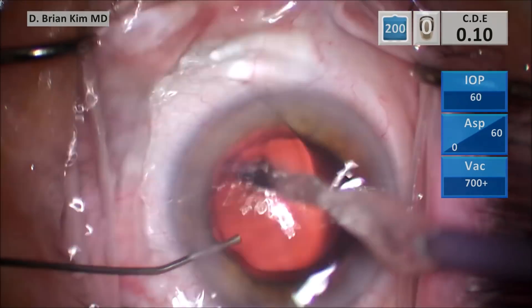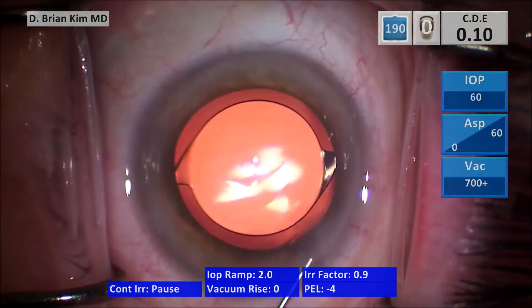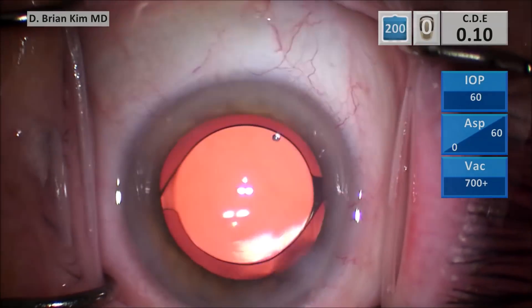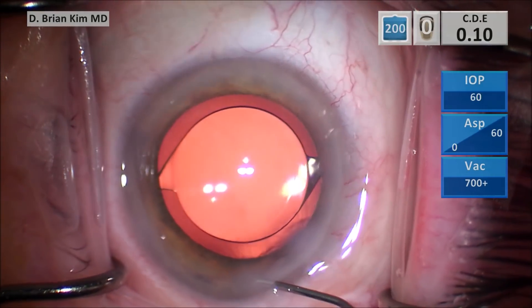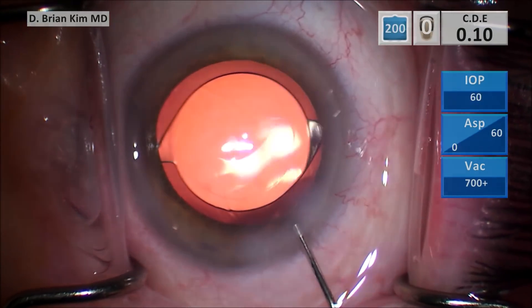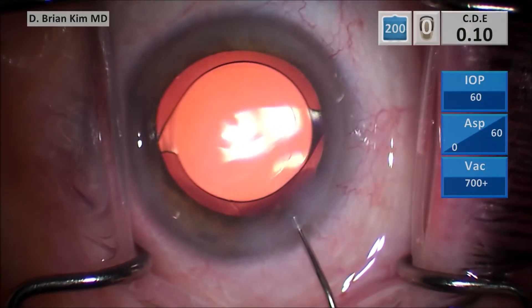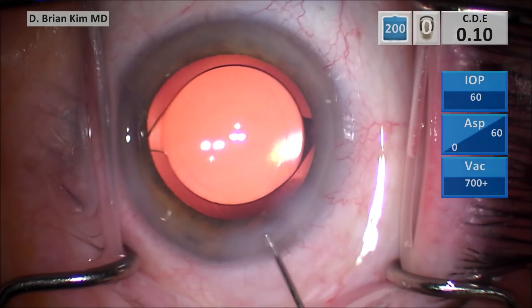As you remove the I/A tip, you perform a fluid exchange by pushing BSS with a cannula into the lens so the chamber does not collapse, where you could inadvertently cause the haptic to prolapse out of the bag.